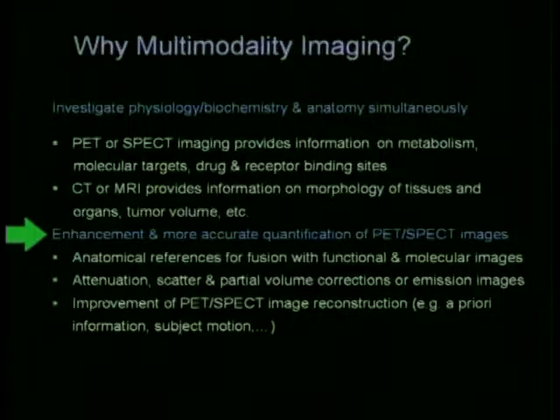So one is the coupling of two particular pieces of information into a single frame, or you can enhance whatever information is coming from a single modality. Like in a PET CT, PET is giving information, but that information is not sufficient to give a diagnosis. So we try to enhance that information.